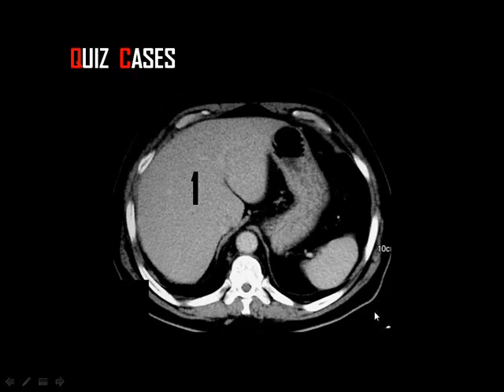Then there are a few quizzes for you, not for the radiologists. You start with number 1, the liver, and number 2, the stomach. Why is it not filled with contrast? Because nowadays some of the radiology centers do not give patients contrast material. They give water instead in order to save money.